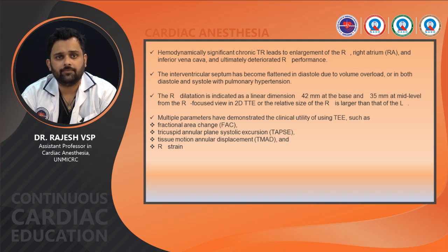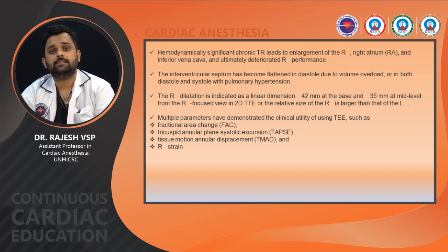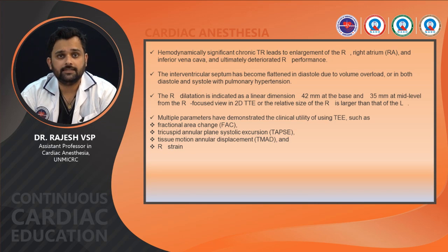of LV. Multiple parameters have demonstrated the clinical utility of using TEE, such as fractional area change, that is FAC, tricuspid annular plane systolic excursion, that is TAPSE, and tissue motion annular displacement and RV strain.